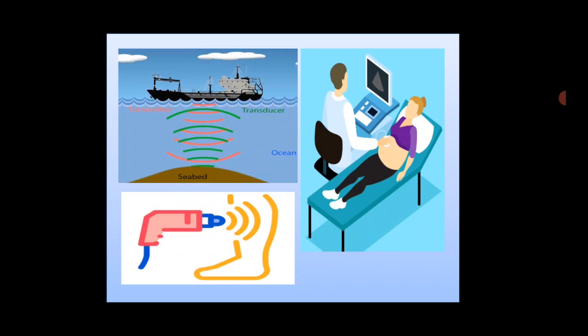Ultrasound is sent from the submarine through the water, then the detector is used to pick up the echo of the signal. Like that, they used ultrasound to calculate the distance to objects under the water. Then it has been used for clinical purposes for the past 50 years or longer.